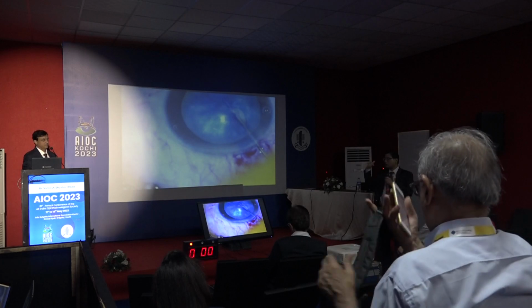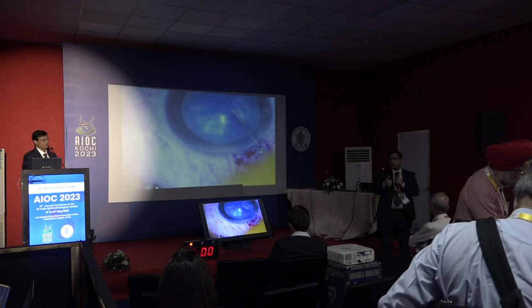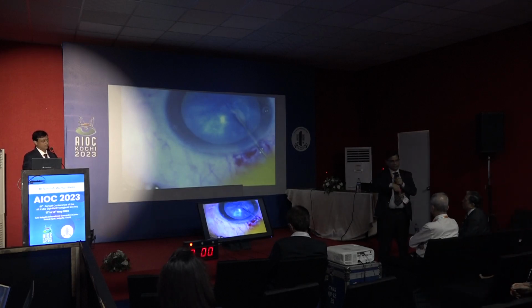Now, when you have a tear which is running to the periphery, you want to inject viscoelastic at the tear and beyond the tear, not in the center. Because when you inject in the center, the liquefied cortex is pushed to the sides as a donut, and when it becomes a donut, your tear is going to extend further. As a reflex, we tend to put viscoelastic into the center of the anterior chamber, and that is doing more harm than good. So that is one aspect.